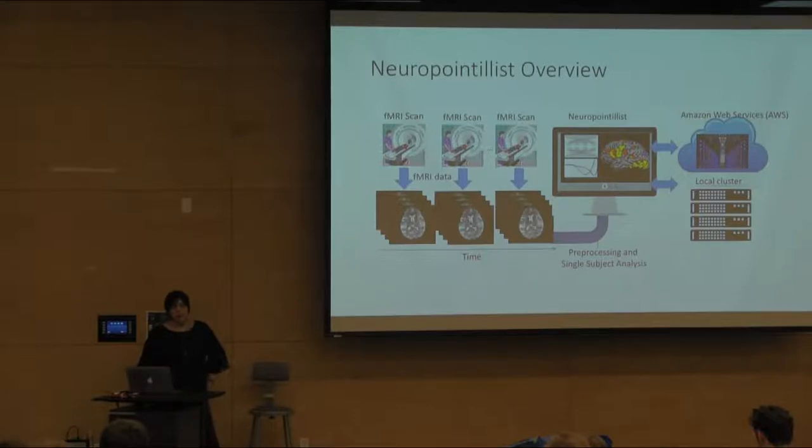essentially what you have is a voxel-wise problem. So it's very easy to parallelize that. It's a massively parallel computation. You split up the voxels into little chunks, and then you farm them out using whatever platform you have. So we have 2 platforms that we are thinking about a lot. The first is just a local multi-core cluster. We can do either a shared memory cluster, or we can do, with SGE, a grid engine type of thing.